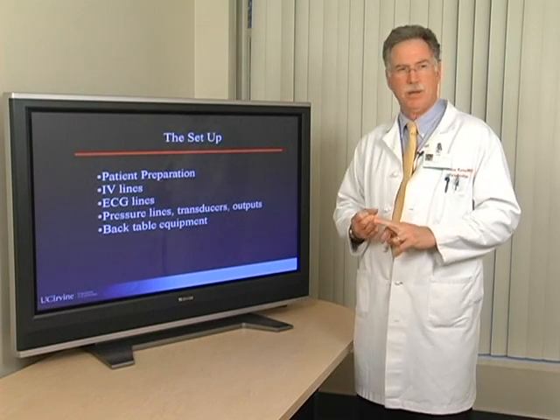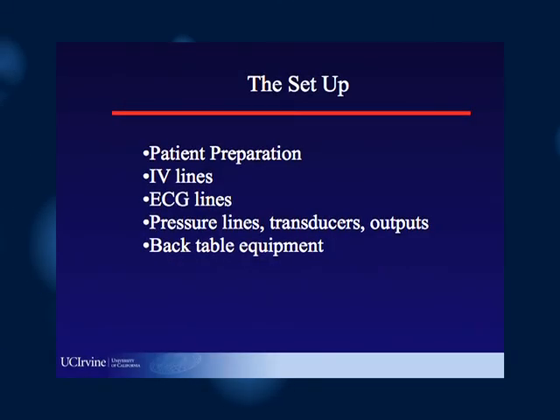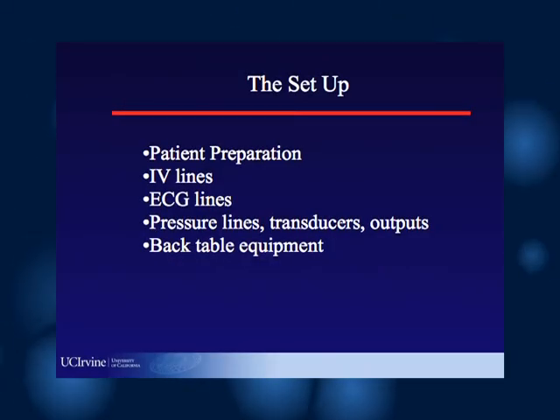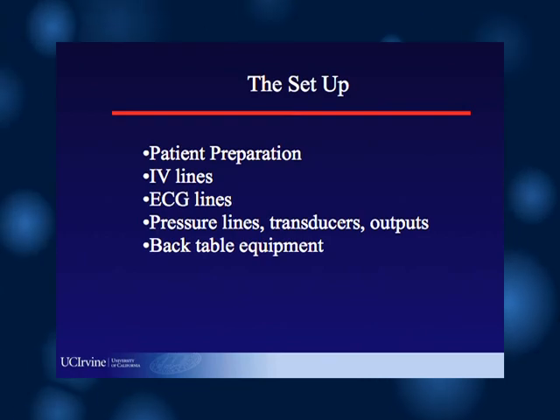When we talk about patient preparation, that means the right indication for performing the procedure, adequate intravenous lines for administering our medication and drugs which we may need to give, always have an adequate electrocardiographic tracing, make sure the pressure lines, transducers, and outputs are clear and hooked up, and that we have all the equipment we need for the study on the back of the table.